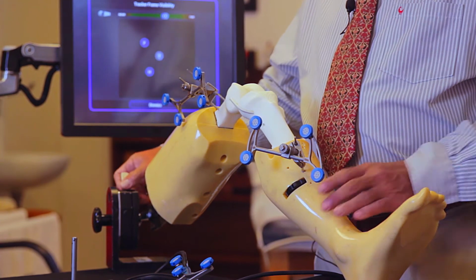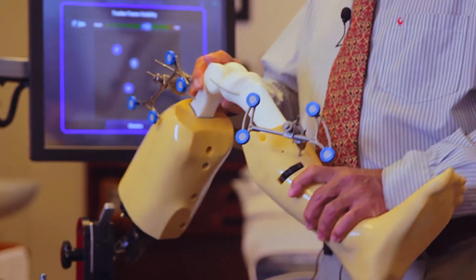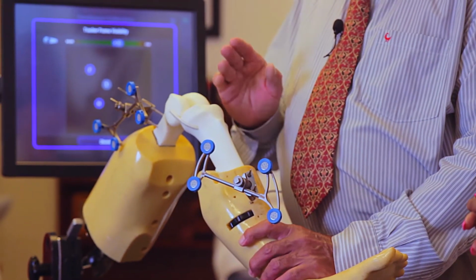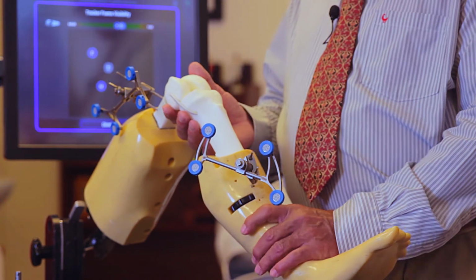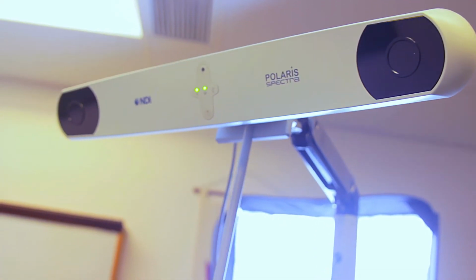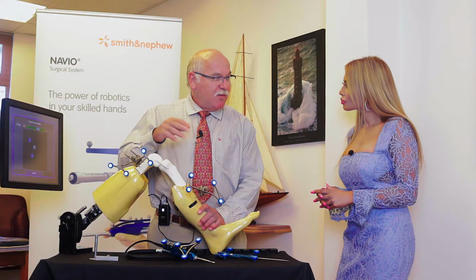A normal knee has its own axis of movement, which we call the functional flexion axis. Each knee has its own unique axis where it wants to move. And each knee has its own specific joint line, which can be from 0 to 9 degrees. That would be the happy zone where the soft tissue is at the right tension. For data collection, we place 2 pins in the femur, and we have arrays which can pick up movement by laser beam. On the tibia side, we also have two pins with 4 arrays, and between them, picked up by the laser, the computer robot assimilates the information.